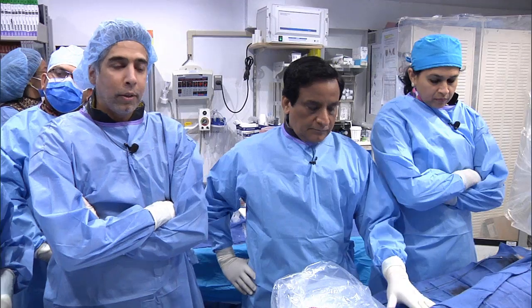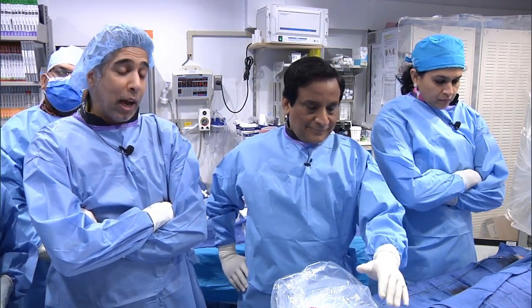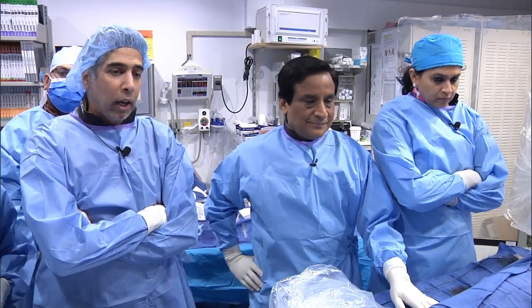Excellent, Nitin. Two quick follow-up questions. Firstly, as a rule, if you are not able to get access via the right radial, will you 100% go to the left radial? That's a little bit operator dependent, I would say. I certainly would do that. That's the true sign of a true transradial believer.